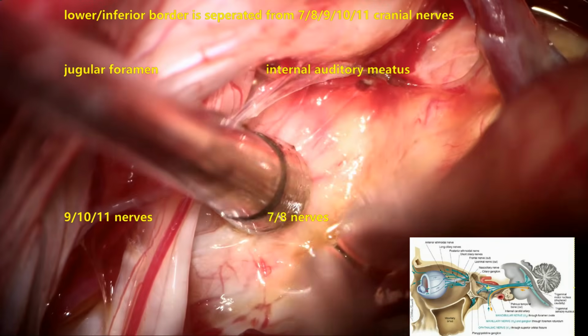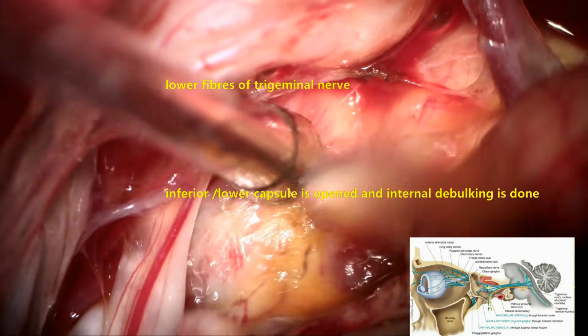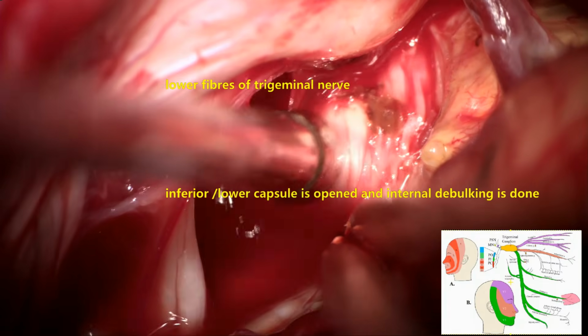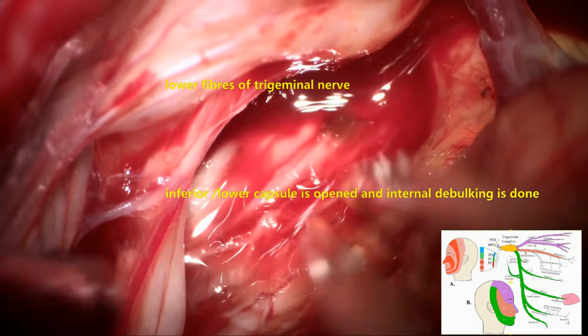the tumor and these nerves through the arachnoid. This plane of cleavage is always maintained. The surface of the tumor is coagulated.